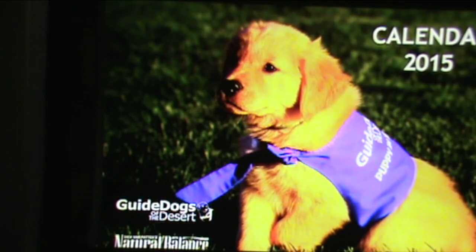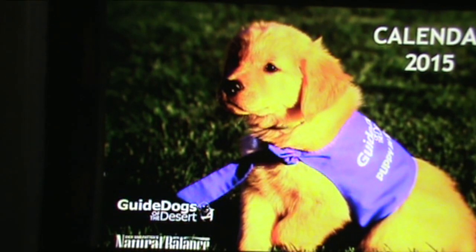Okay, now that we're looking at the video magnifier here, what we've done so far for clarity on the camera is we've turned off our lighting so that we can actually get a really good image of the video system on the camera. So one of the things that you want to be able to do when you choose a video magnification system is you want to choose something that has really good optics and also has a really good monitor. Those are the two important things that you need to be aware of. I'm going to show you some techniques to determine how good the optics are and monitor system.